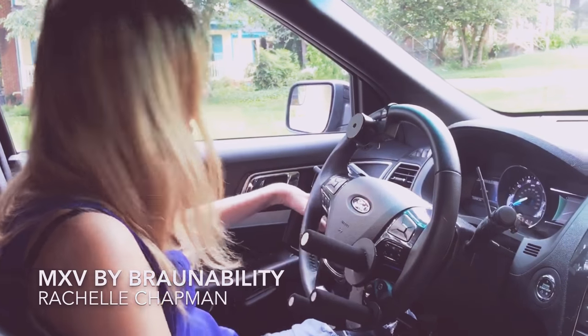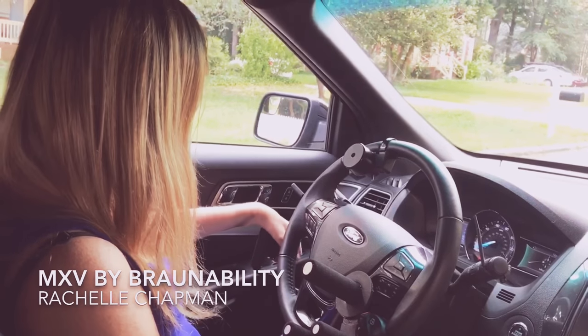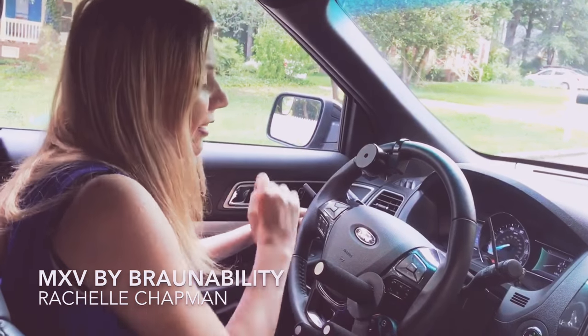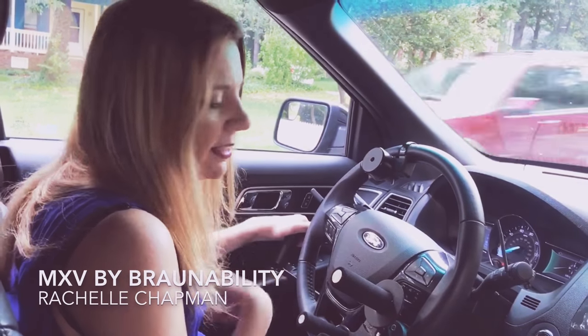Right here is my gas and my brake. I push down for gas. And then I push forward for brake. Basically this little hand control goes down to the pedals, and it's like touching them. So that's what makes it work.